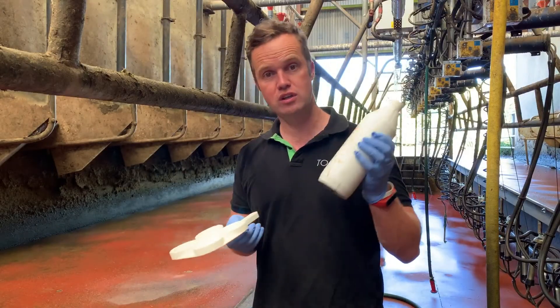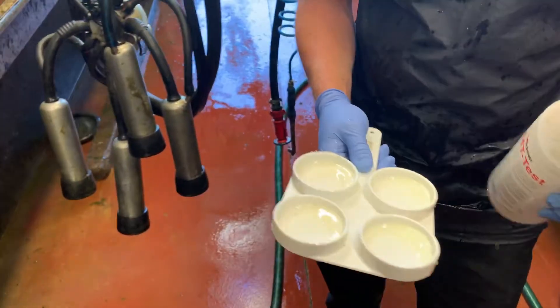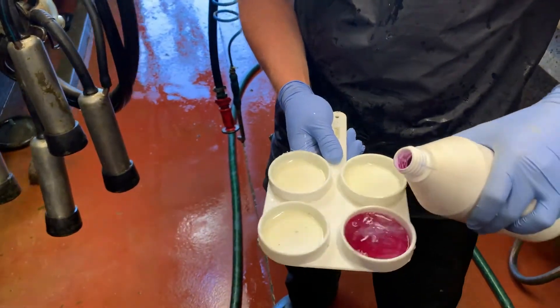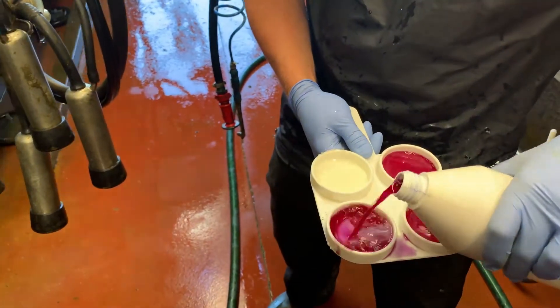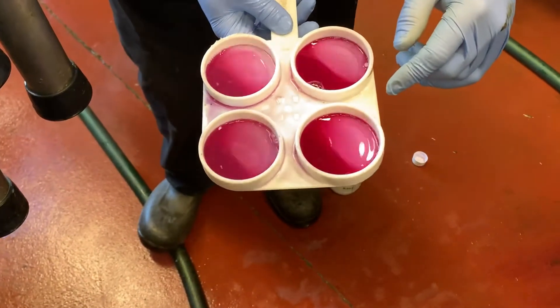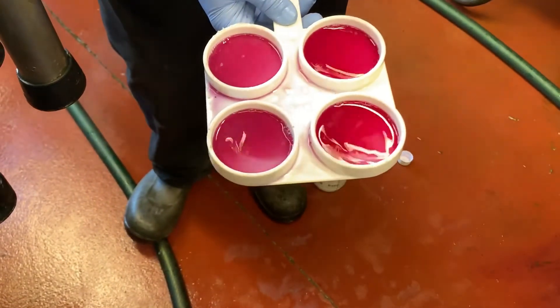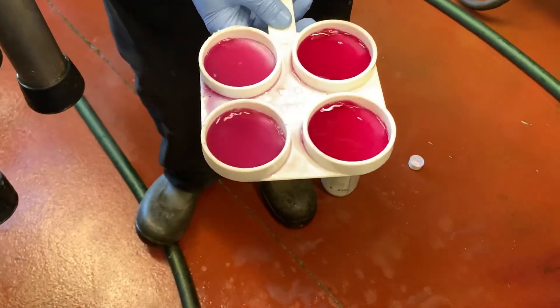Then you're adding your California Mastitis Test solution to each of the wells in the paddle and gently swirling. Your hand action is really important — give it about 10 seconds. With an equal volume of milk and an equal volume of solution, you're looking for a gelling reaction.